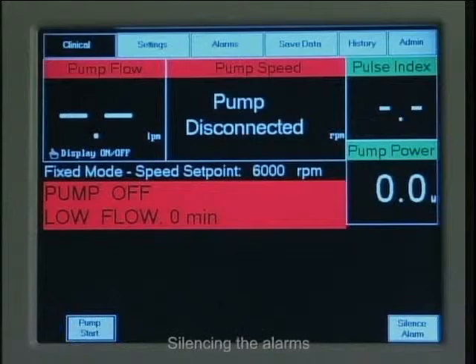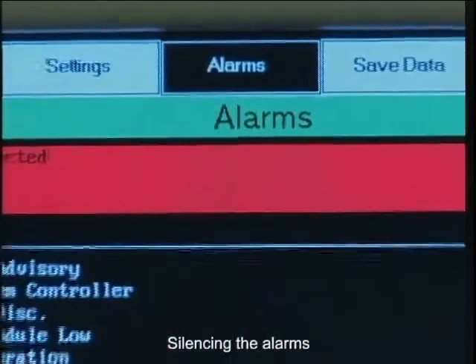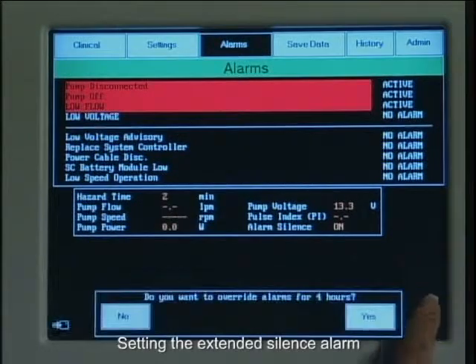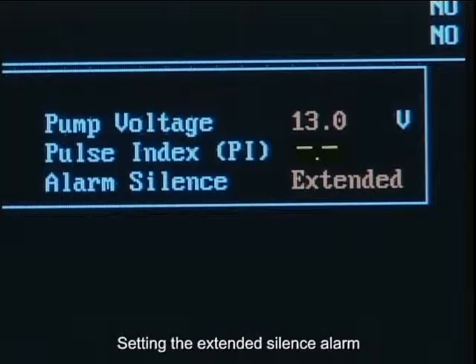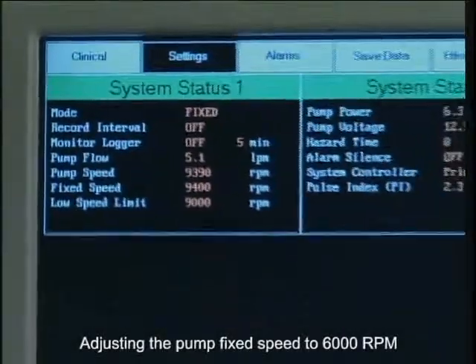Silencing the alarms on the system controller and power module. Setting the extended silence alarm. Adjusting the pump fixed speed to 6000 RPM.